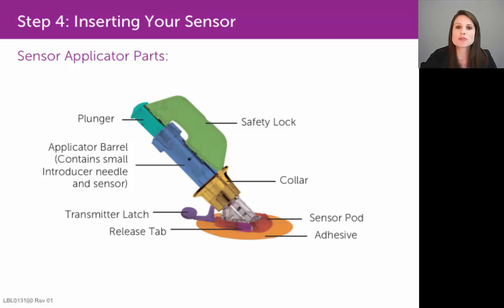Once you've done that, you're going to remove the applicator barrel from the sensor pod. You can do that with the release tabs labeled there in fuchsia. They feel like little ridged tabs on each side of the sensor pod — you're going to pinch those release tabs together, and that will release that applicator barrel from the sensor pod.